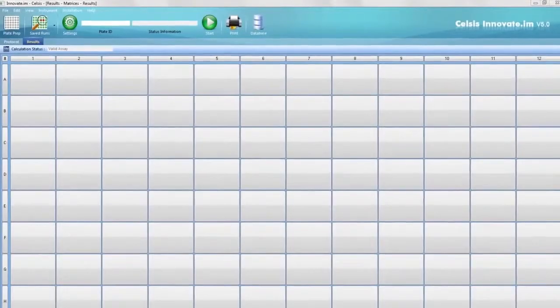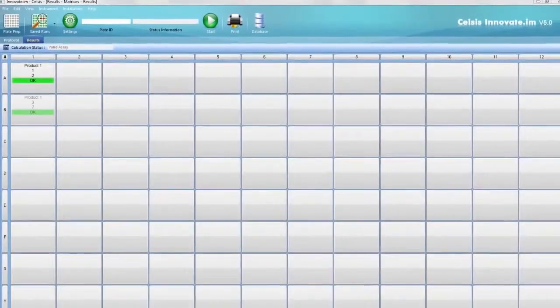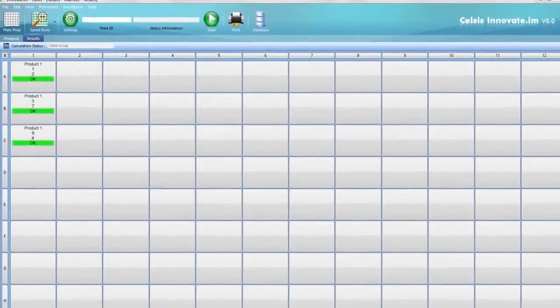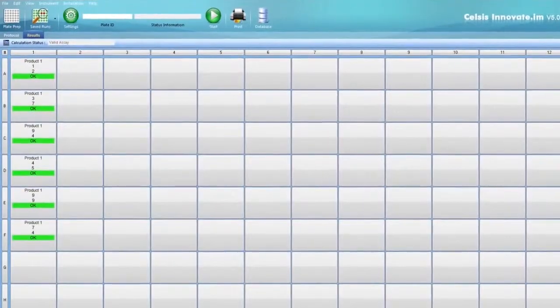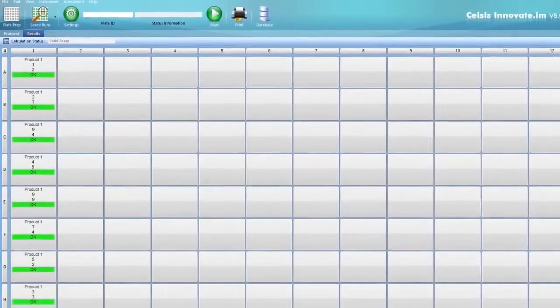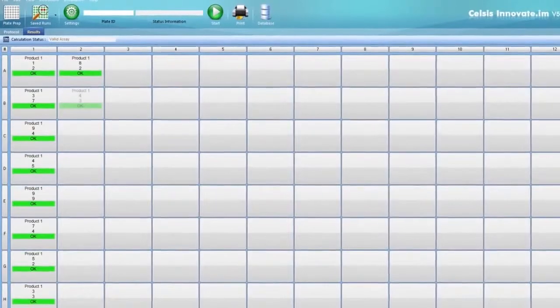The Innovate.im software controls the timed injection of reagents and measures the output in relative light units, or RLUs. Test results are displayed in real-time in a clear, easy-to-interpret grid that mirrors the plate setup.